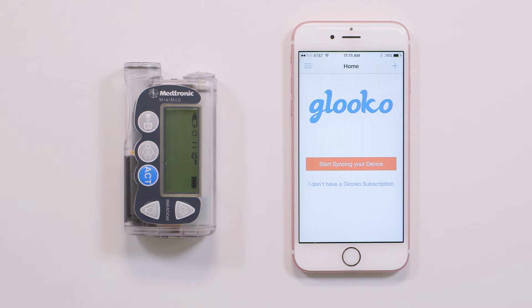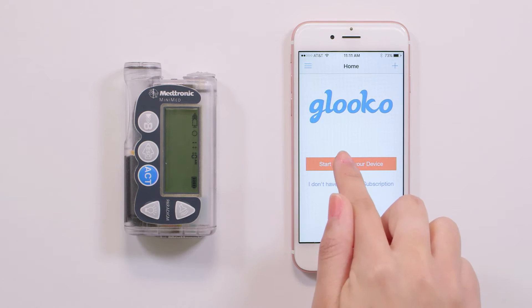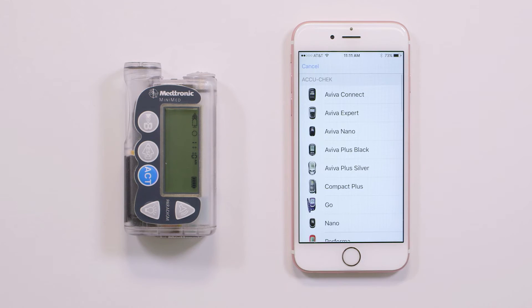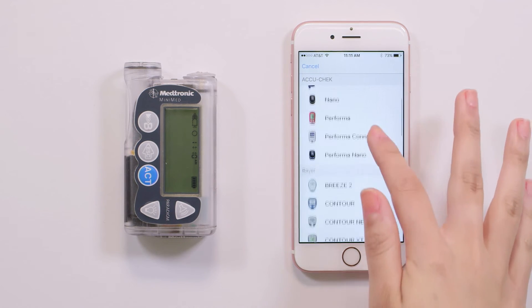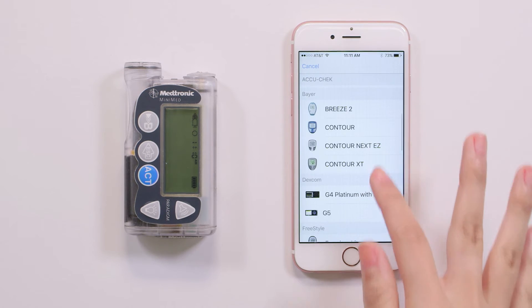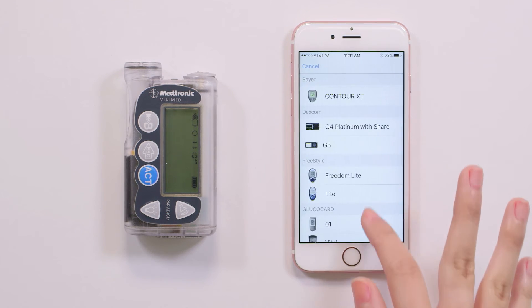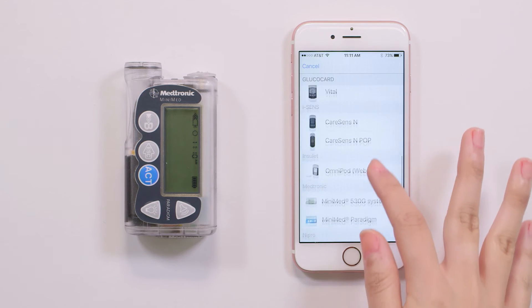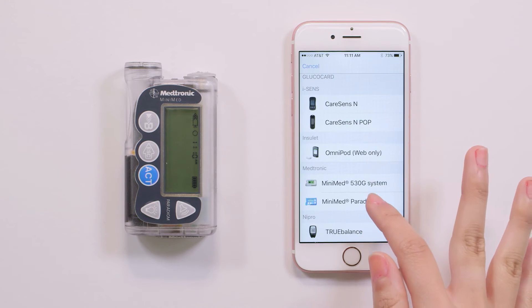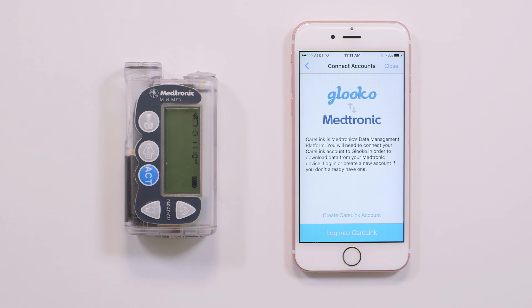From the home screen, tap 'Start syncing your device.' You'll find our list of supported diabetes devices. Scroll down until you see your Medtronic device and tap to open the connect account screen.